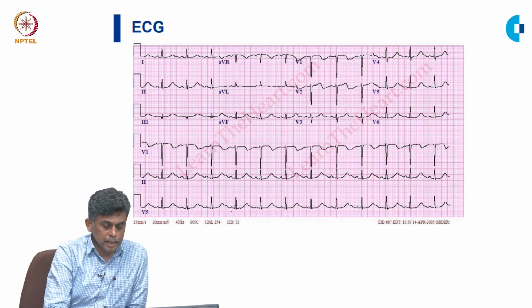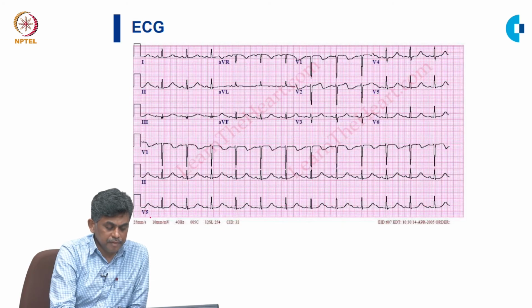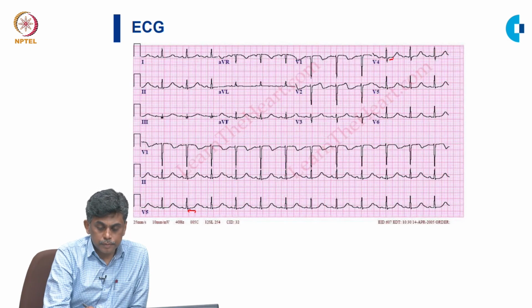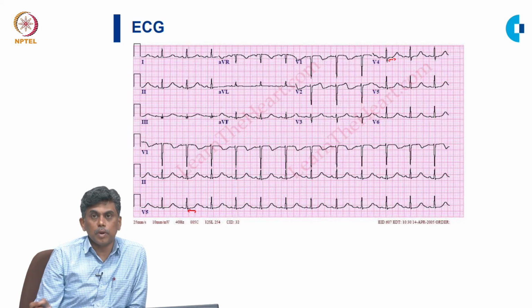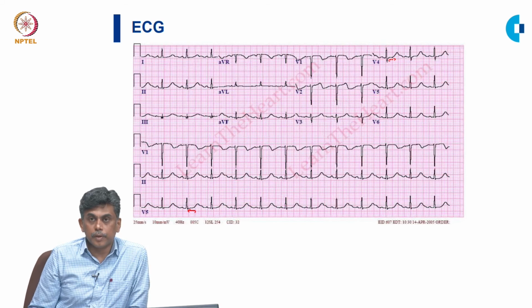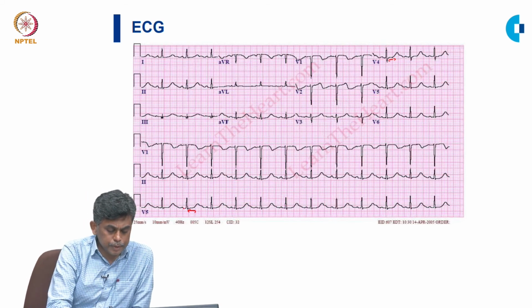Now there is one lead at the base, that is what? V5. Now it is given. Now you see the ST segment looks a bit long. Okay, all the ST segments look a bit long. So then you know ST segment means what? It has to do with the calcium. Okay, and when the ST segment is long, what happens to the QT interval?